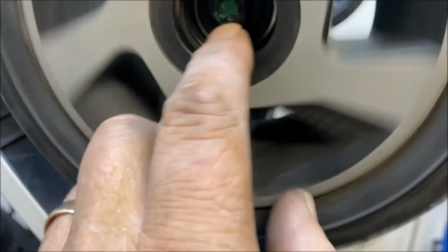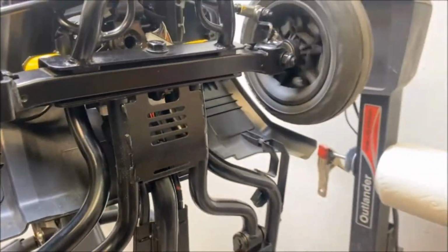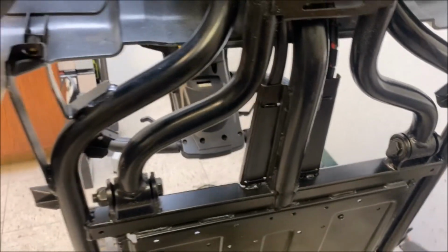These have got lock springs on them, but as a secondary measure you could put blue Loctite on there, just so the wheels turn freely enough. So yeah, I'll take the wheels off. That's the next job, and then just finish what I can, getting into cleaning the frame up and a bit of dust on the shroud.